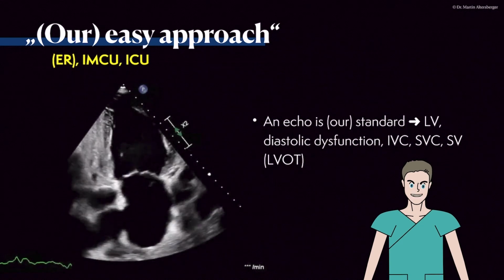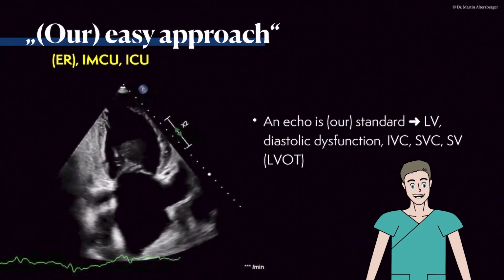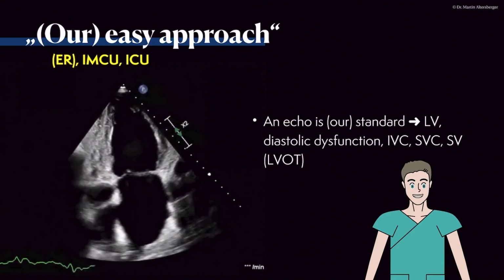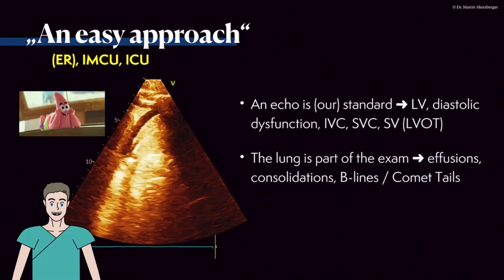We look at the VTI and the pulse wave Doppler at the LVOT, the IVC, the SVC. So when a patient is admitted to our intermediate care unit or intensive care unit, we have the echo as our first-hand standard.